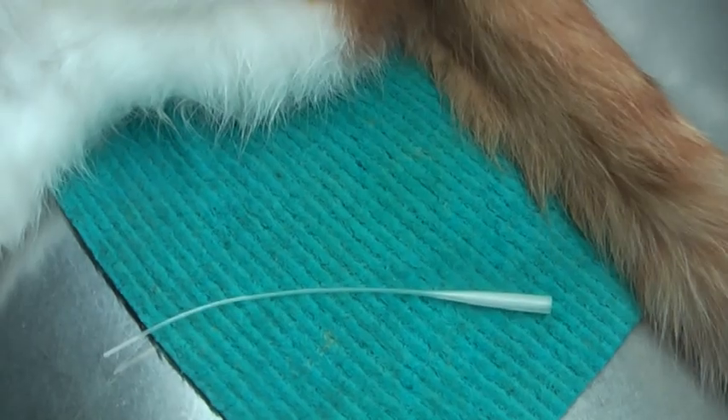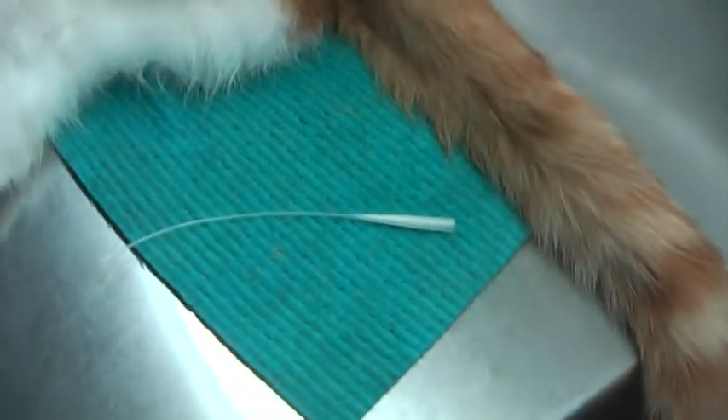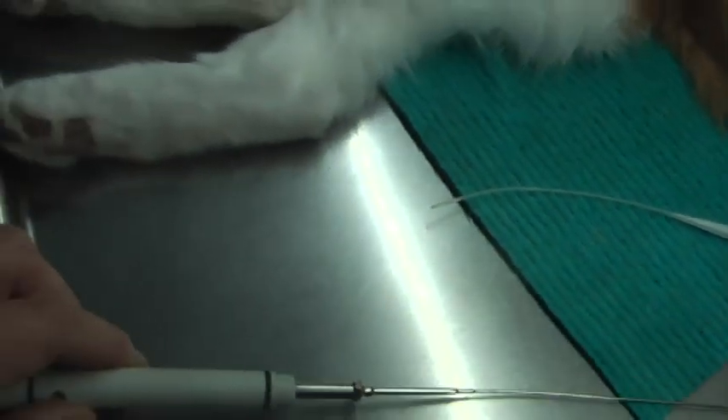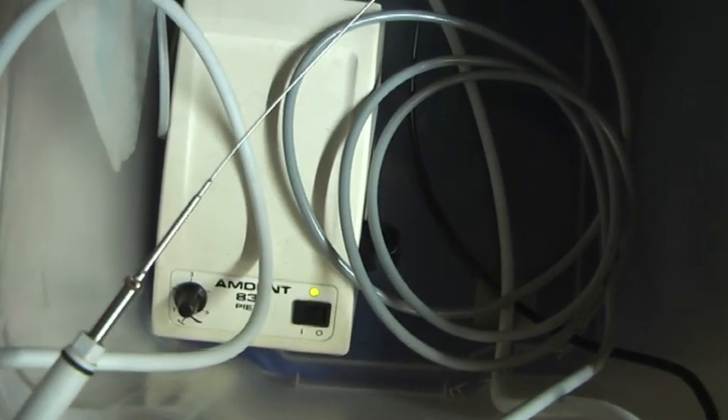This device is absolutely great — it works with water and ultrasound. By comparison, this one here is used for cleaning plaque on teeth, also very helpful.